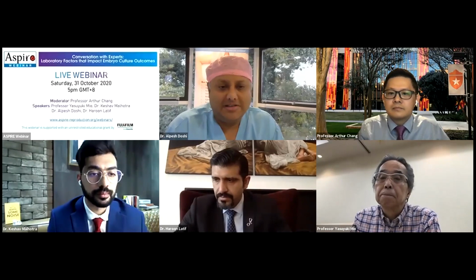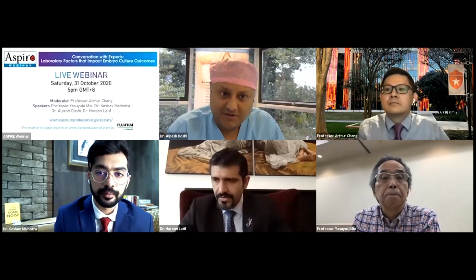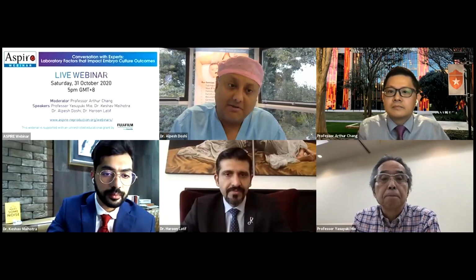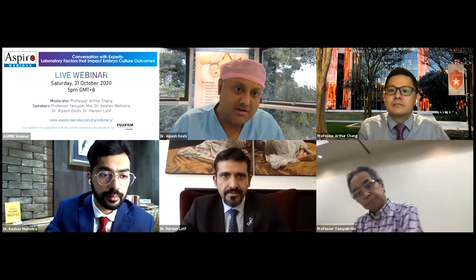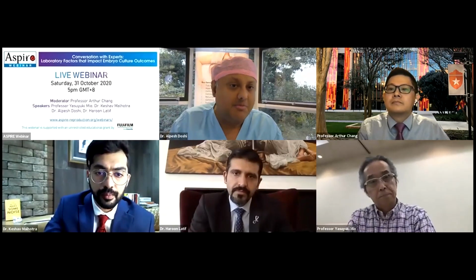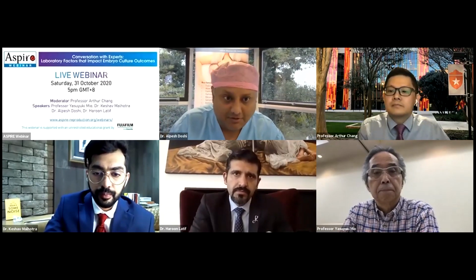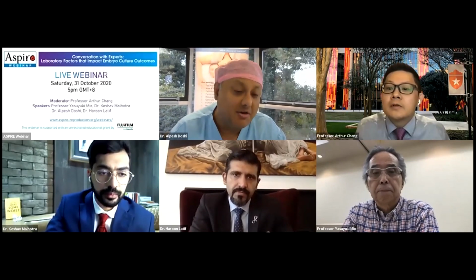Again, I would say that you need to seek the opinion of the manufacturer of the laser, because it could be 150 milliwatt or it could be 400 milliwatt. If it's a 150 milliwatt laser, you need to then increase your millisecond exposure. If it's a 400 milliwatt laser, then you need to lower the millisecond exposure, because ultimately this relates to the amount of energy dissipated at the embryonic level. What was the other question? It was about the size of the hole.